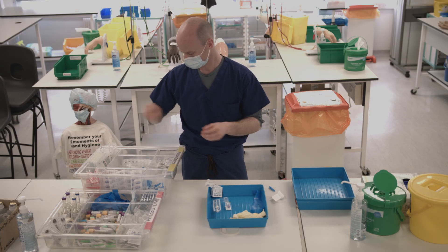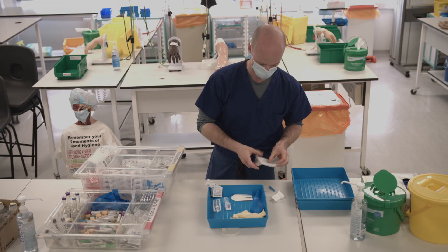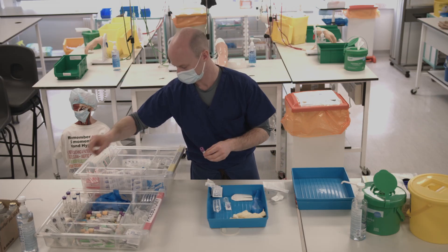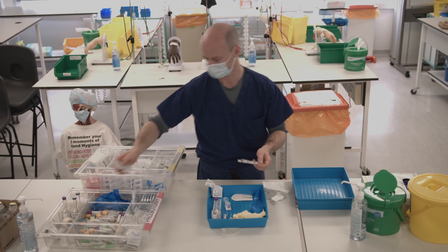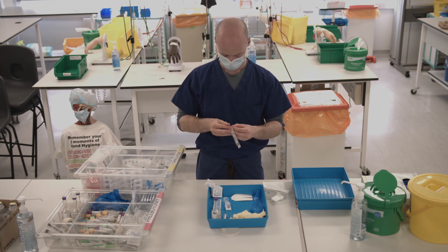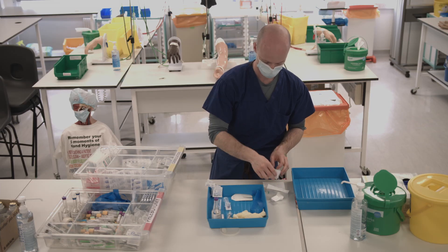You will also need a cannula plaster, a purple blood tube, aerobic and anaerobic blood culture bottles — though here I have only one — a VBG syringe, and finally a saline flush, which you'll need to prepare.